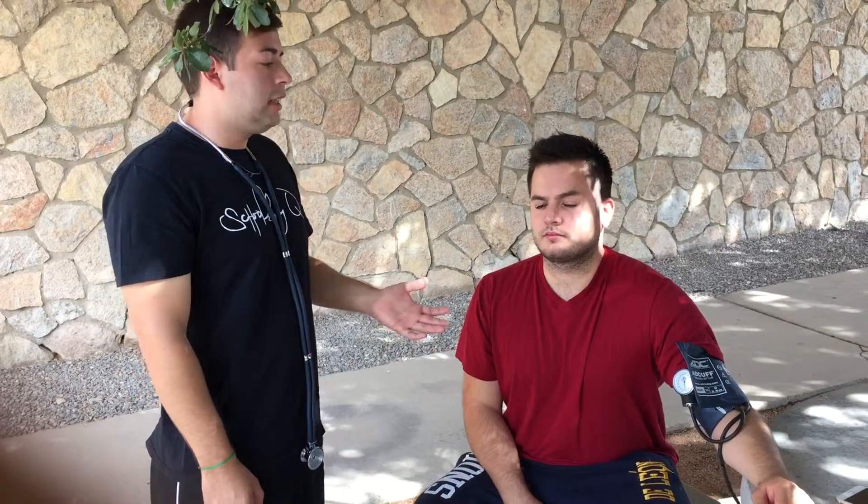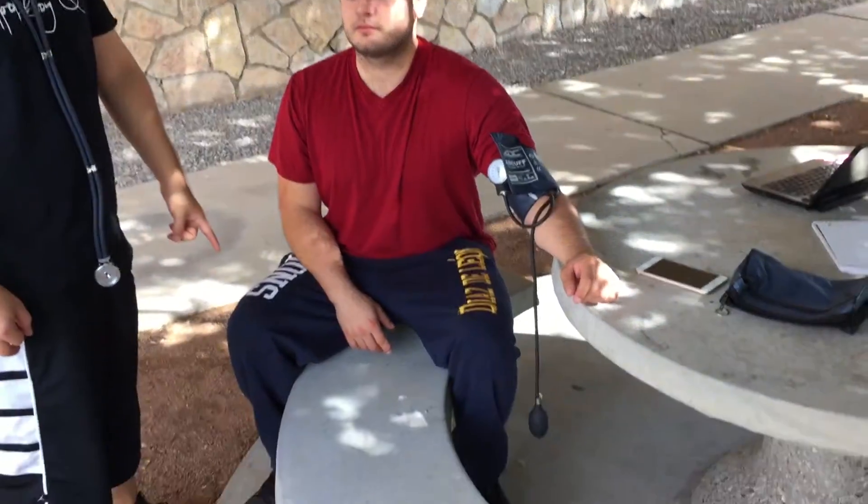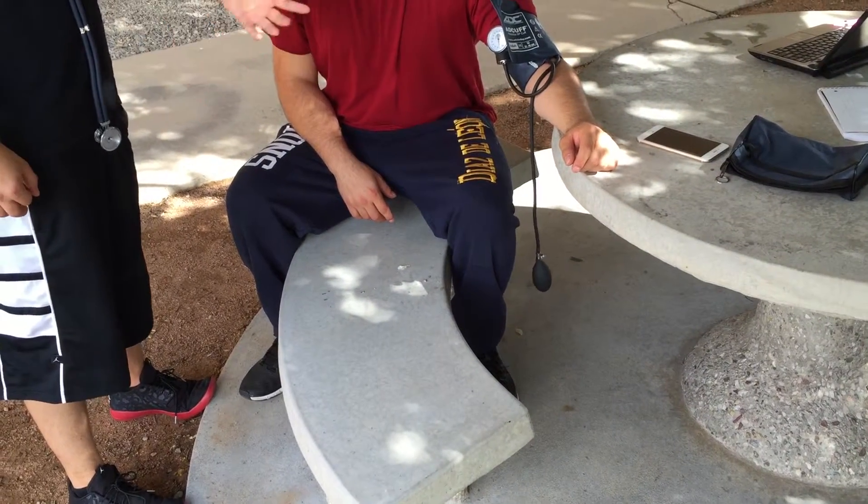Hello everybody, my name is John and today I'm going to be teaching you how to take a blood pressure reading. My subject right here is sitting upright, his legs are flat on the floor, and his arm is at about heart level. You want to try to take the blood pressure reading on their left arm — the left arm is the best arm. It is also important for the subject not to consume any nicotine, caffeine, or any other substances that might alter his heart rate.